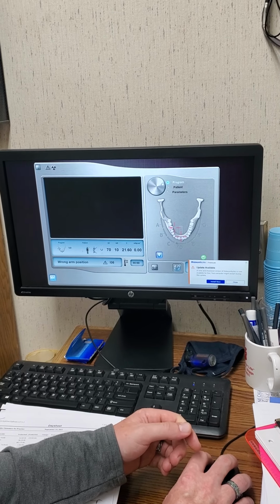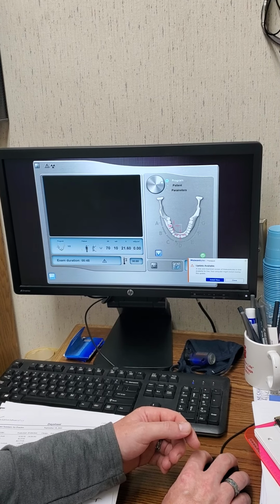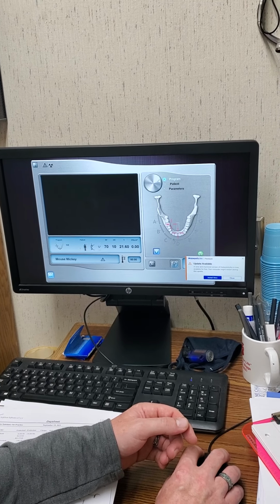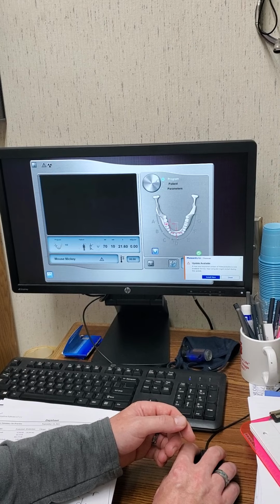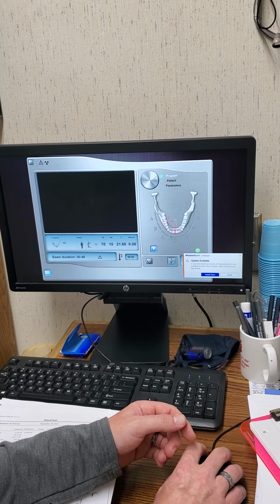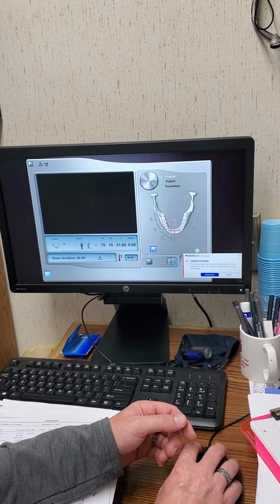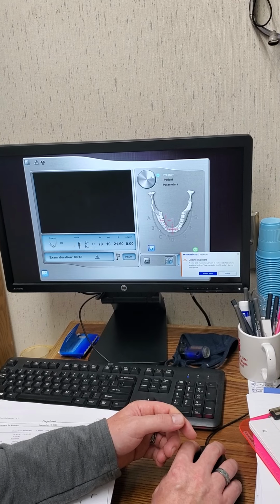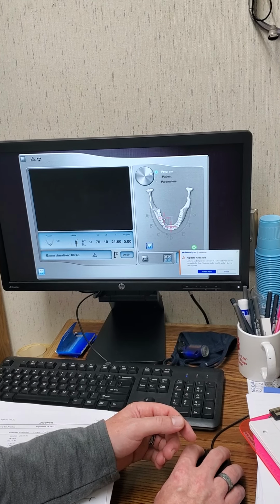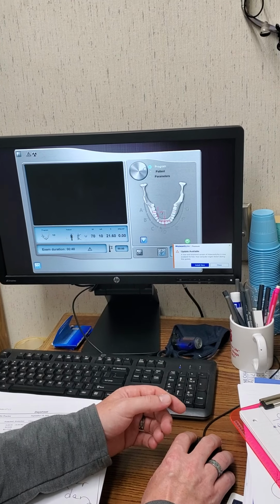Do you need to move that target back to the last place or just leave it in place? This little one here that moved, since we had positioned it before, if we want to just do this entire quadrant, now we can click that button and it will recenter it back to here. So now it will take. And you don't have to move the one that's kind of over 3 all the way back. You just leave it there. It doesn't move. Okay. Gotcha.